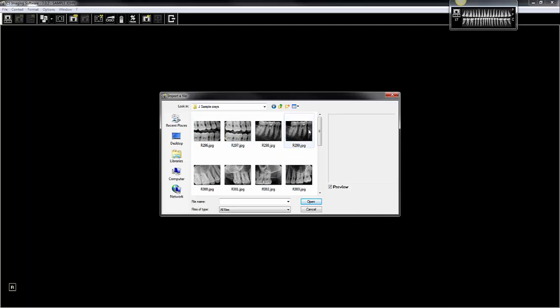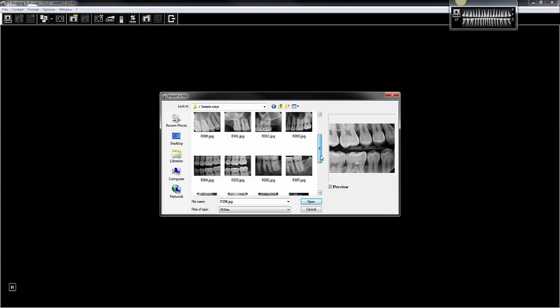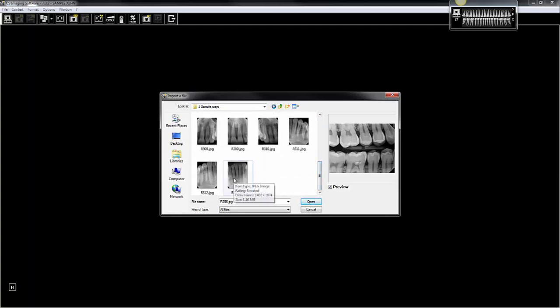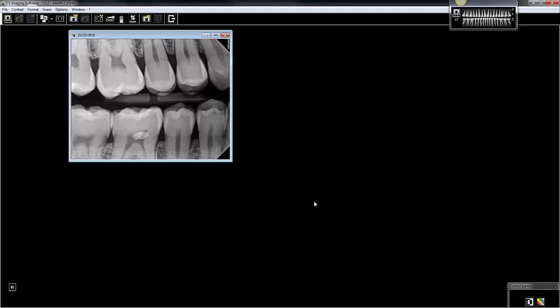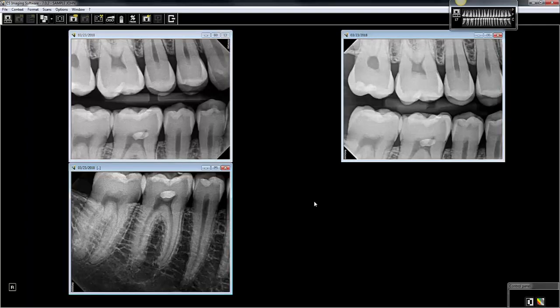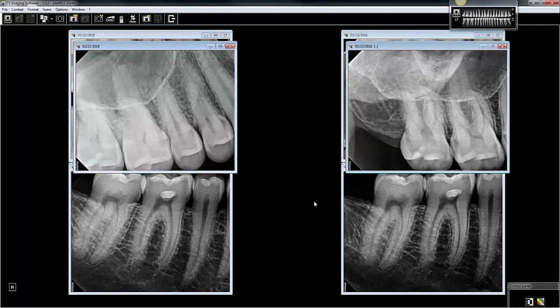Make sure you're at the top of the list, left-click on the first image, hold your shift key down, scroll to the bottom, and left-click on the last image. That'll select them all. When you hit Open, it's going to pull them all in at the same time.